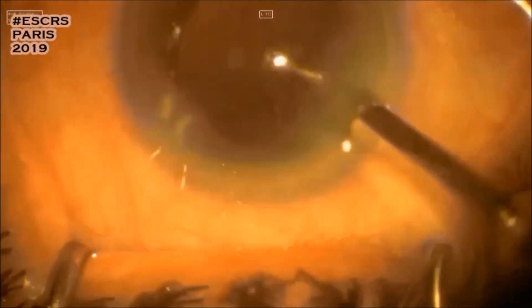Removing the lens cortex was the most challenging step in this case because of sub-incisional corneal edema.